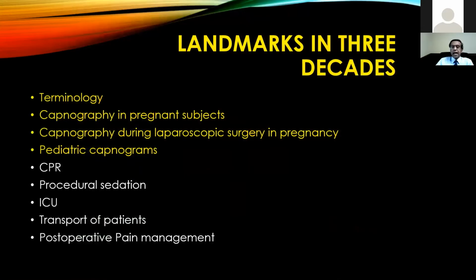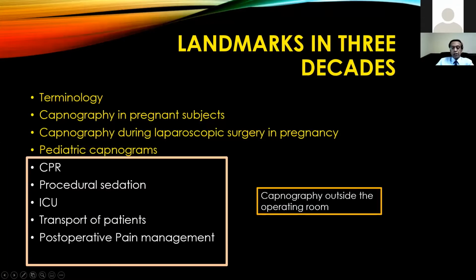Now, when you look at the landmarks in the last 3 decades, there are a lot of changes that have happened in the terminology of capnography, capnography in pregnant subjects, capnography during laparoscopic surgery in pregnancy, pediatric capnograms, and outside of the operating room, particularly CPR, procedural sedation, intensive care units, transport of patients within the hospitals and in between the hospitals, and postoperative management.